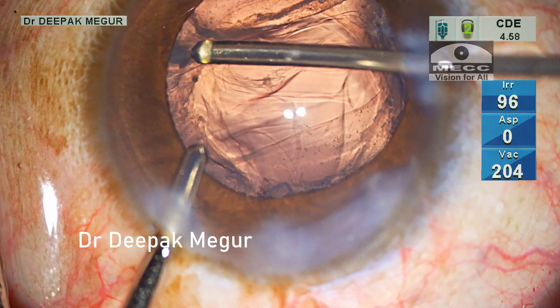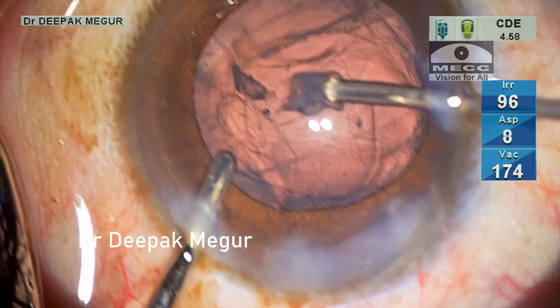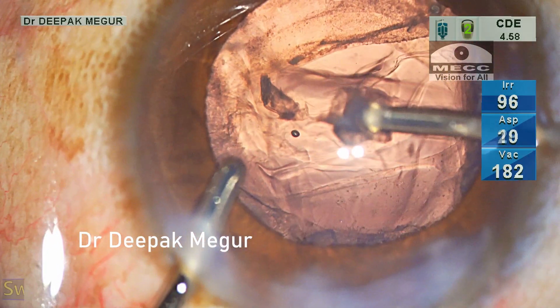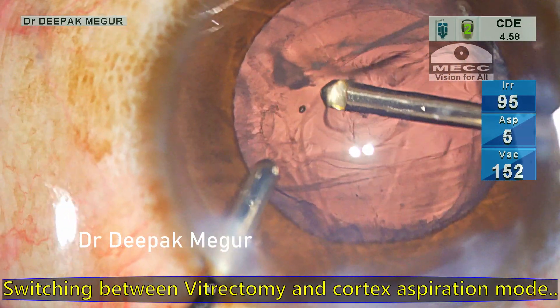Once the vitreous is cleared, I switch to cortex extraction mode and I am removing the cortex using the vitrector itself. It's a great tool to remove both the vitreous and the cortex, and we can switch between the two modes whenever we suspect that vitreous is prolapsed.